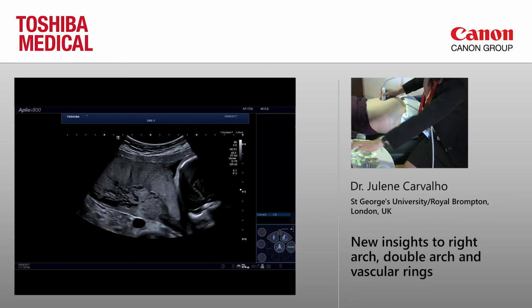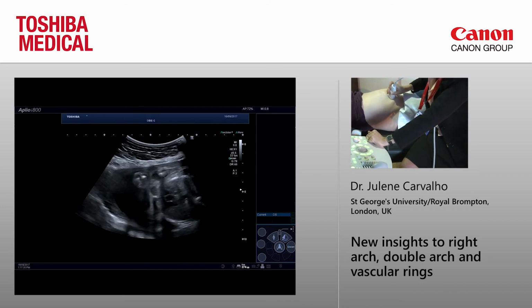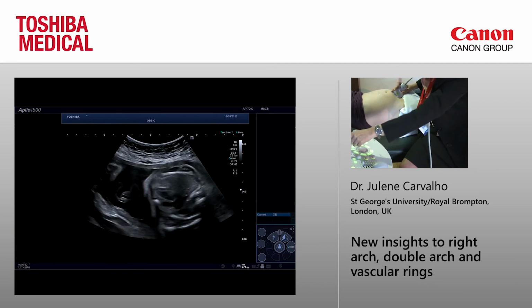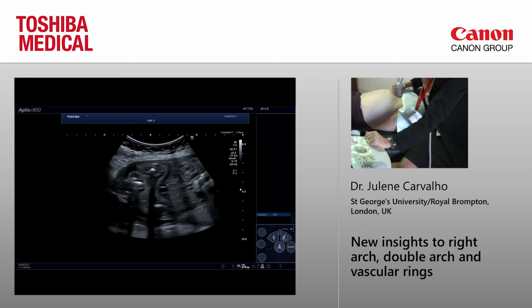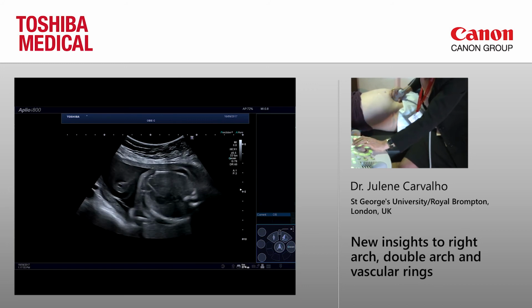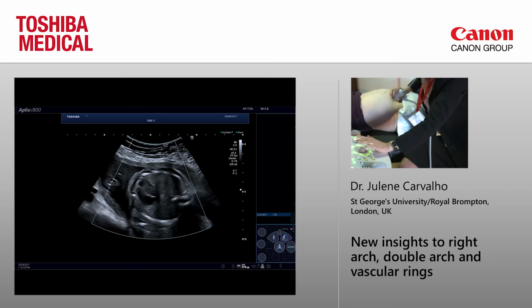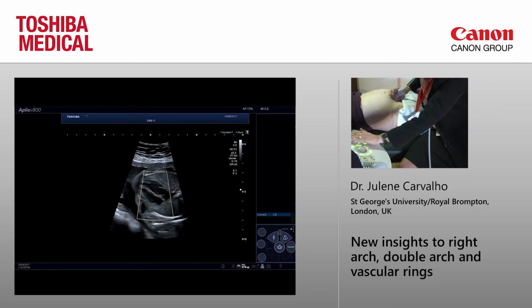So this fetus is head up, so it's in a breech position. It has moved a little bit. Let's just find the position of this fetus. It's always worth spending a bit of time with the screen very wide to try and find where the fetus is, find the best position, and this baby is going to move. Narrowing the sector. Maybe make it a little bit bigger.